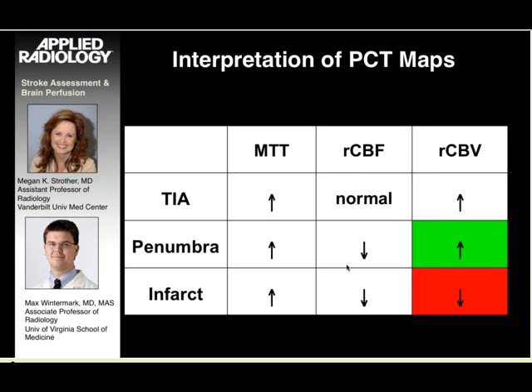And then you can use those thresholds that Dr. Strother mentioned, 145%, 2 cc per 100 gram, but that applies only to a specific type of software, namely those using deconvolution. The concept will still work with all other software, but the values for those thresholds will be different.